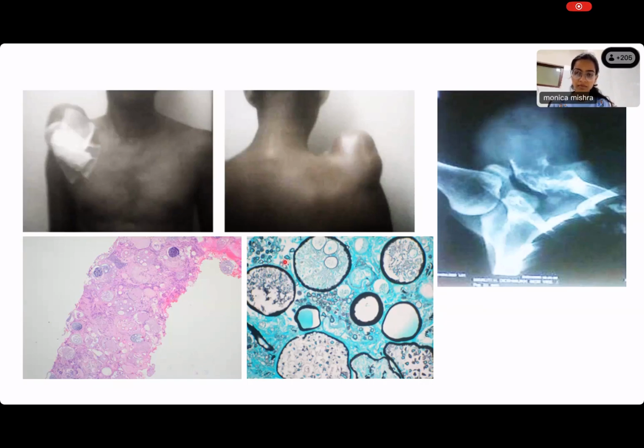So inside, you know that fungi have spores. So you see all these fungal organisms, and there are big sporangia, and inside them you have the spores of the fungus, in smaller capsulated sporangia. You have big sporangia, you have small sporangia, and you see these spores. So what is this organism? It's not a parasite. Yes, Monica. What is it? You rightly called it a sporangium. So rhinosporidiosis.